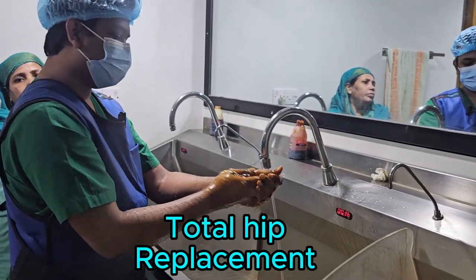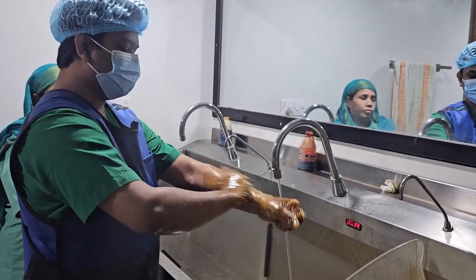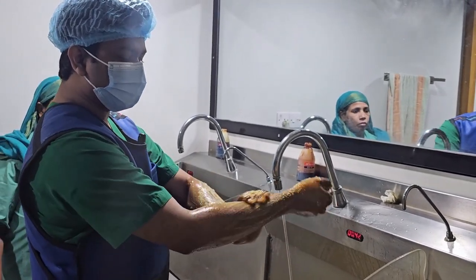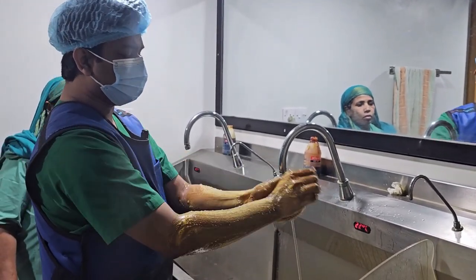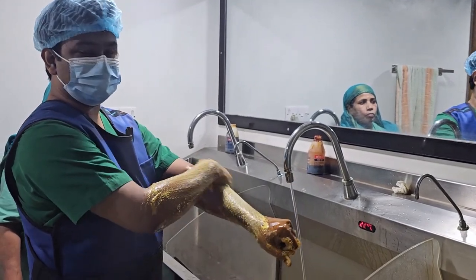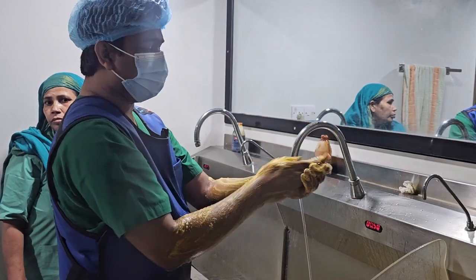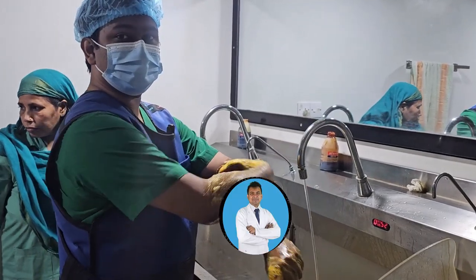Total hip replacement. I will show you a brief overview — this is a hip replacement surgery video made for patient education purposes. I will show you a total hip replacement.